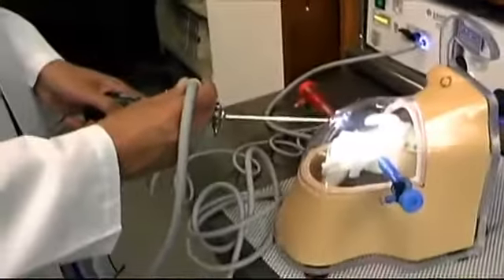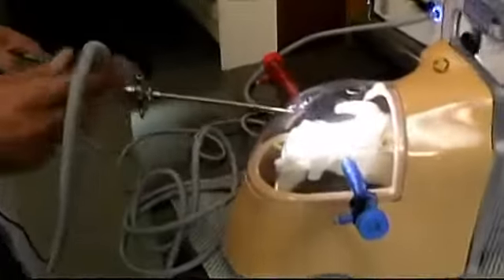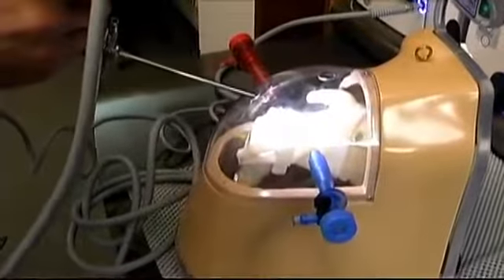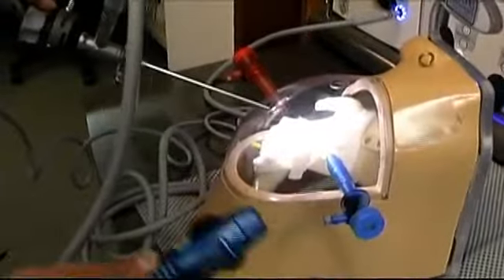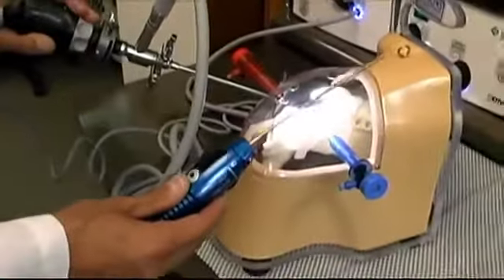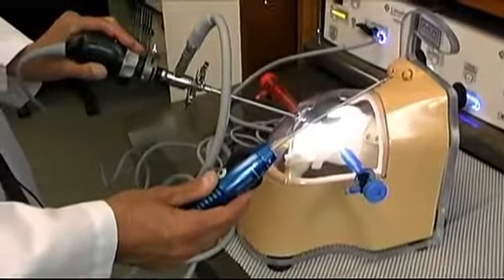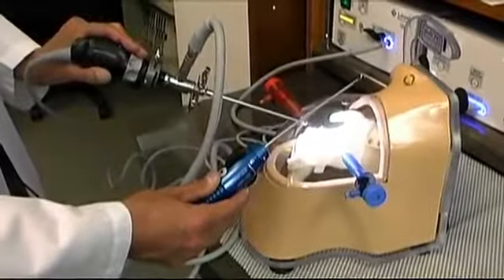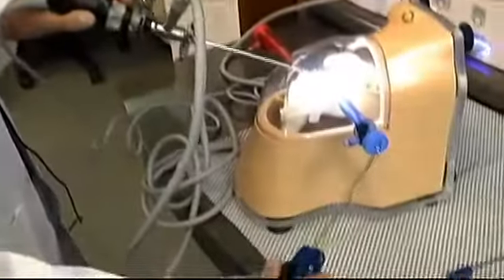The camera itself can be placed through a tiny little poke hole in the side of the shoulder into the shoulder itself. The rest of the procedure can be done with instruments that we have here in the classroom. These instruments are the actual instruments that we use in the OR. Now, these are retired versions. We don't bring these from a live patient to the classroom and back, but these have been used in actual surgery, and these are the real instruments that we practice with.